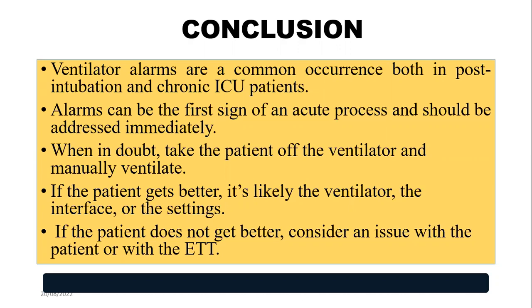So as a nurse, the take-home message is never ever silence the alarm without knowing the reason. The alarm can be due to the ventilator settings or the patient parameter or the support system like the gas cylinders or the pressure points or the electrical outlet. So please identify the reason for alarms, attend to it. Get help from the biomedical engineers or the respiratory therapist or the intensivist before everything gets settled. So be attentive when you hear or see a ventilator alarm at any point of care in the intensive care unit.